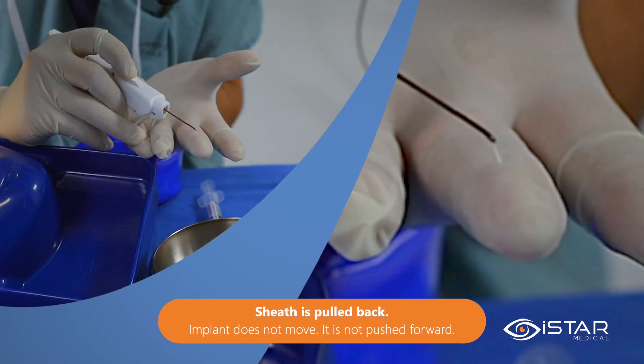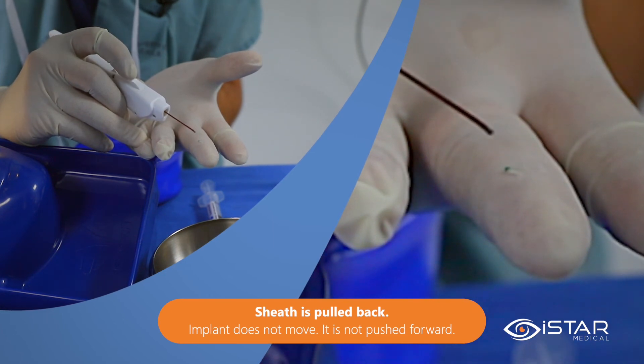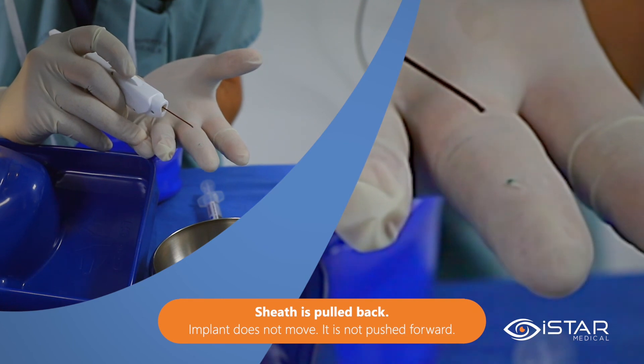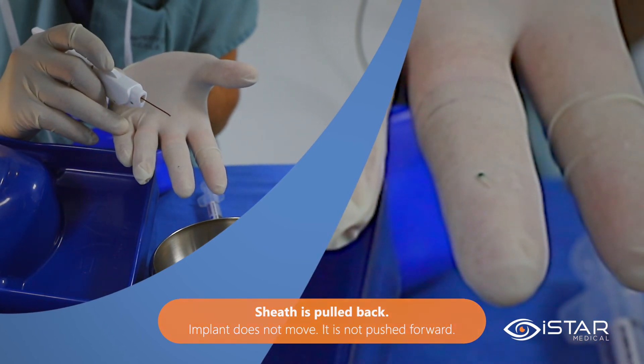This is important to understand how the device works, which is basically to allow it to lay within the supraciliary space. Here you can see the actual implant on my finger. It is made of soft and flexible medical grade silicone and so easily conforms to the eye anatomy.